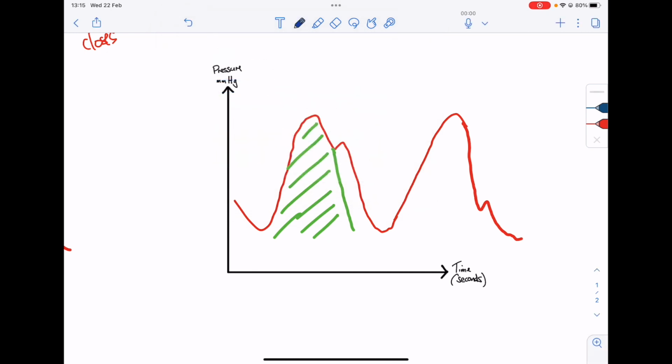It's important to remember that this bit of the waveform is coming about because of the elastic contractility of the aorta, i.e. your valve is closed and you're getting a spring back of elasticity against that valve that subsequently leads to an increase in pressure in the aorta as it bounces around a little bit, is how I imagine it.